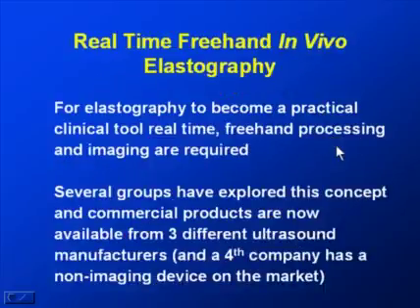For elastography to become a practical clinical tool, however, we really need to move from quasi-static algorithms to real-time freehand processing, and that is what's come online now more and more with the different manufacturers. There are several groups that have explored this concept, and as I mentioned, there are currently 3 different ultrasound manufacturers that have devices on the market that can do elasticity imaging, and there is a 4th one which has this non-imaging device, which was the French company.